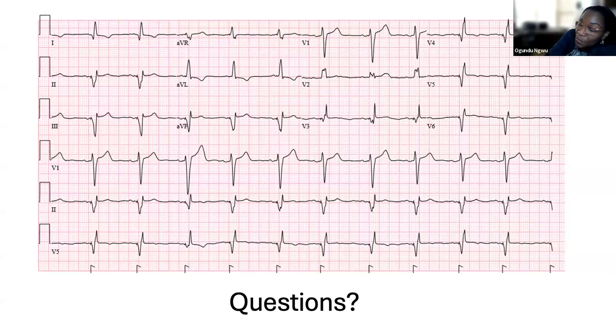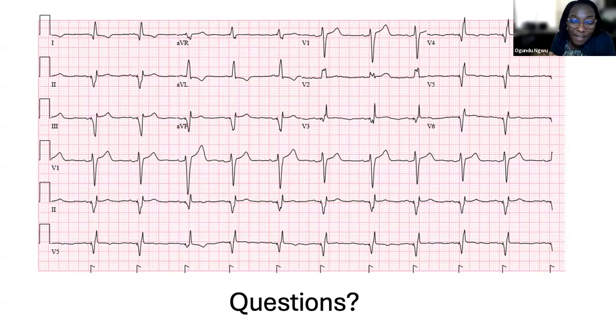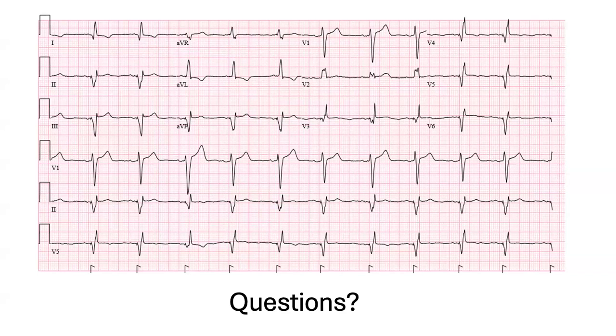The same battery. What I'm saying is that when I did his initial implant, I couldn't get into the LV. So instead of doing a dual chamber, because I knew I had to come back because he's very young, I plugged the LV port, hoping to come back in a few months and see if I can get in. Now if I go back in and I can't get the CS because this valve just won't get out of the way, even from below, then at that point I will put a pacing lead into the left bundle and change the generator out and put in one where I can put in two pacing leads and still leave his ICD lead. Perfect. So same device, different device.